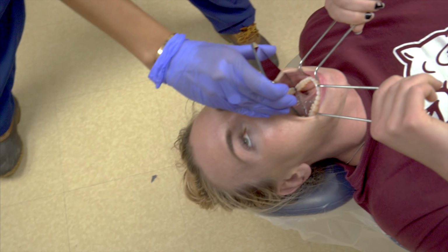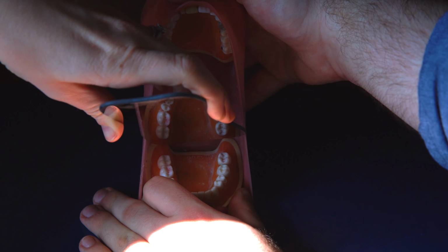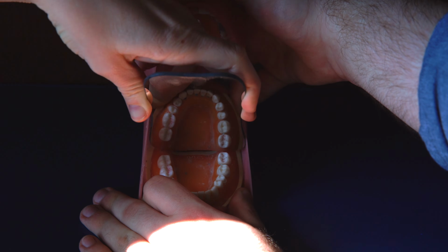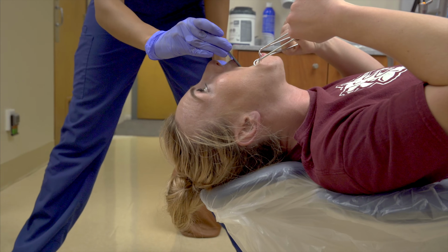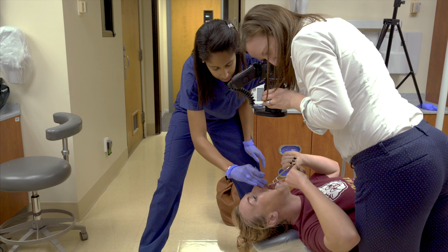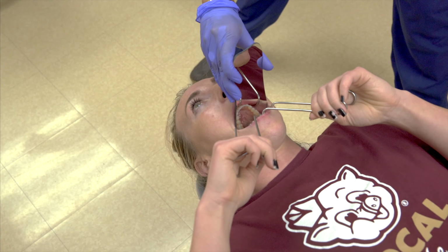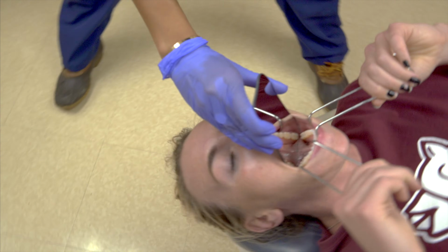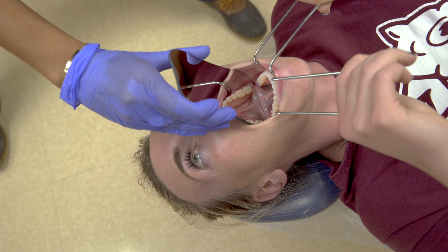To do this, we lay the patient flat or declined in the chair, then tilt her head back as much as she will tolerate. We use the 4XL mirror for these images. Place the distal end of the mirror on the retromolar pad and tilt the mirror as far open as the patient will allow. On the patient, place the cheek retractors to pull the lower lip towards the patient's feet and have her hold them. Then ask her to put her tongue up to the roof of her mouth before placing the mirror. That way the tongue does not block any of the teeth in the photograph.